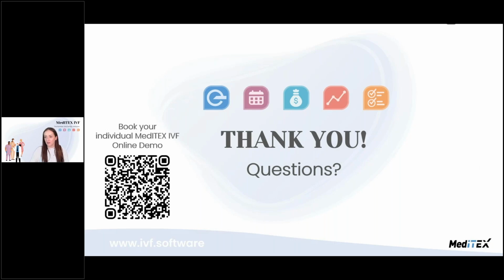You mentioned that you charged per logged user. Am I able to share one account with my colleague from the lab? Yes, this would be possible, but you cannot be logged in at the same time. So if you work in different time schedules, this could be possible, but having one license and then two people working with that account is not possible.